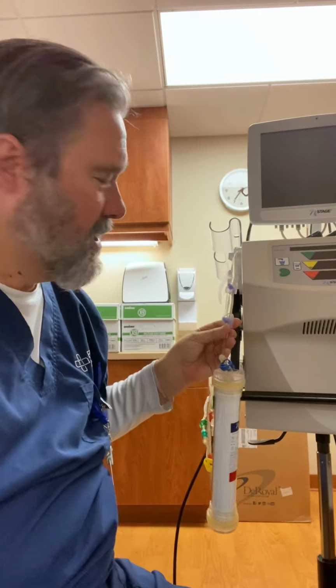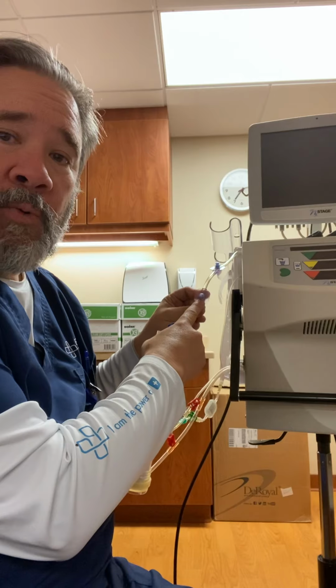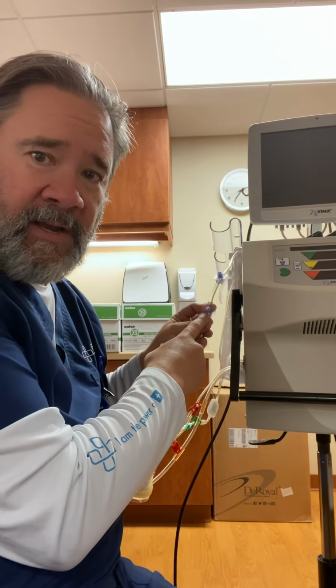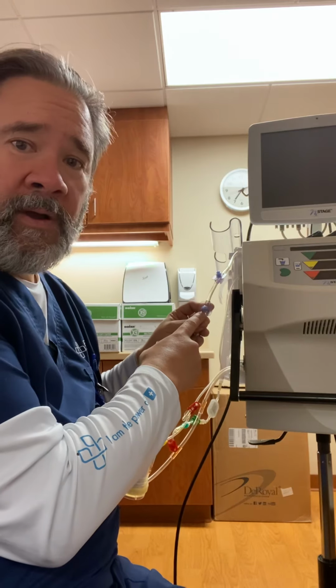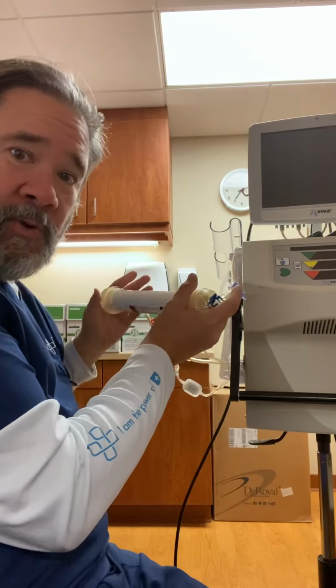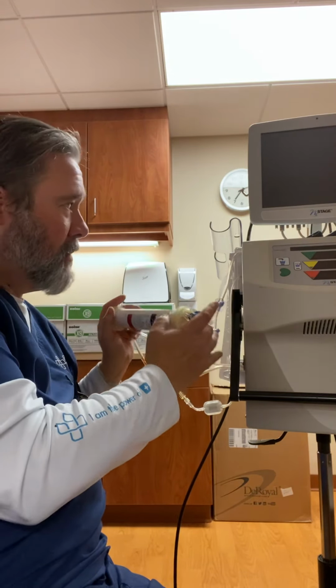We're going to check an ionized calcium. Your order for that is going to be post-filter ionized calcium. And so if it's below 1, we're going to decrease our citrate by 10. If it's above 1.6, we're going to increase our citrate to make sure that we're 1 to 1.6 within the filter so we don't clot.